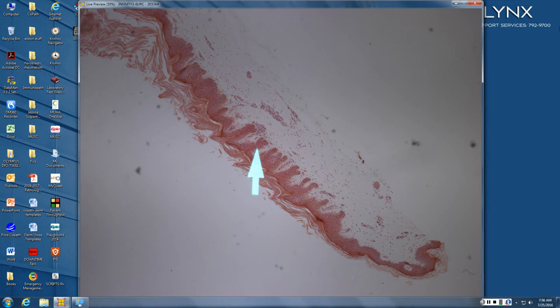If you look, the cells are somewhat large, right? Sebs usually have small keratinocytes, smaller than the surrounding normal keratinocytes. These are larger than the surrounding keratinocytes, but there is a weird variant of Seb that merges with large cell acanthoma, where it usually has some features of lentigo, some features of Seb, and the cells are large.